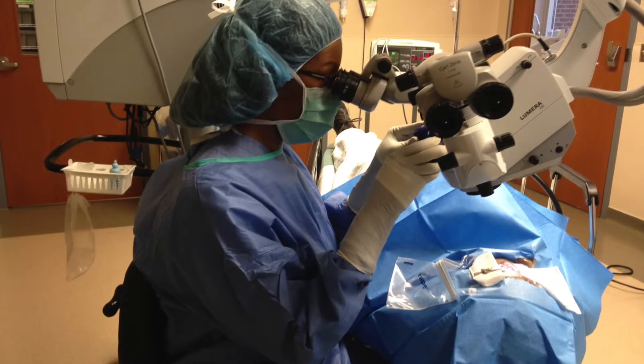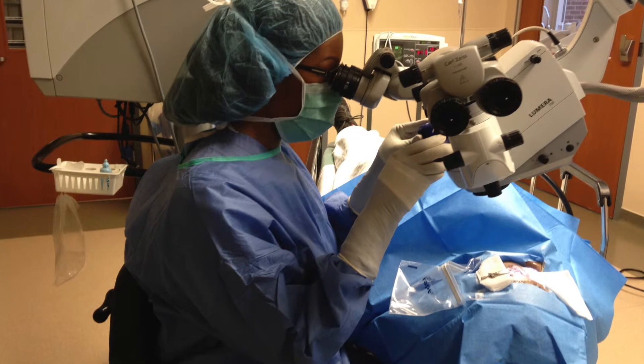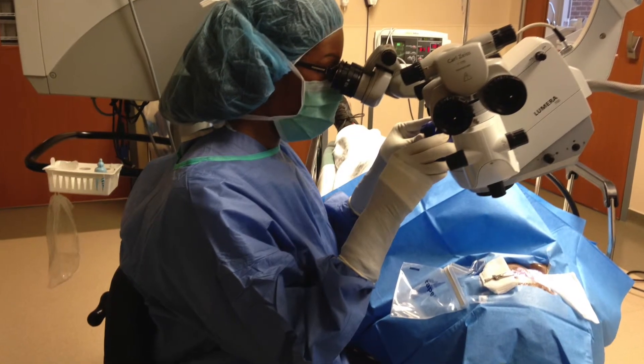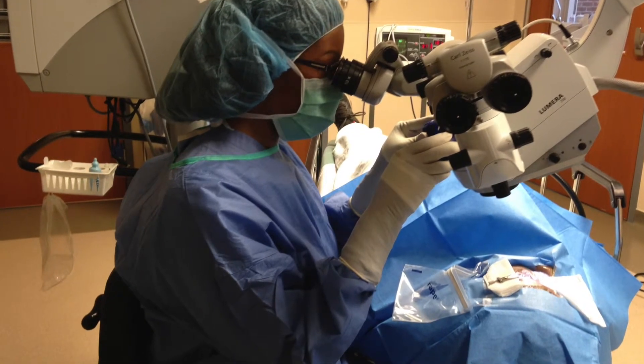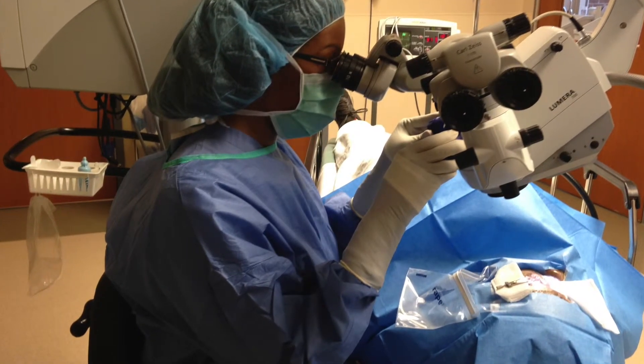Angle the microscope about 45 degrees towards the surgeon. This is needed in order to get an adequate gonioscopic view.